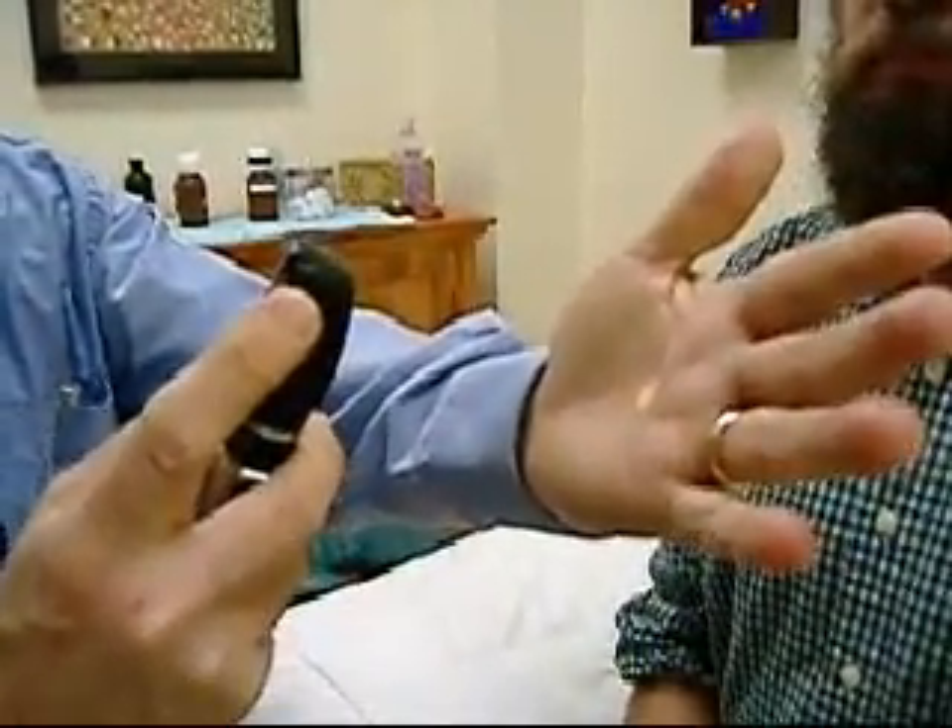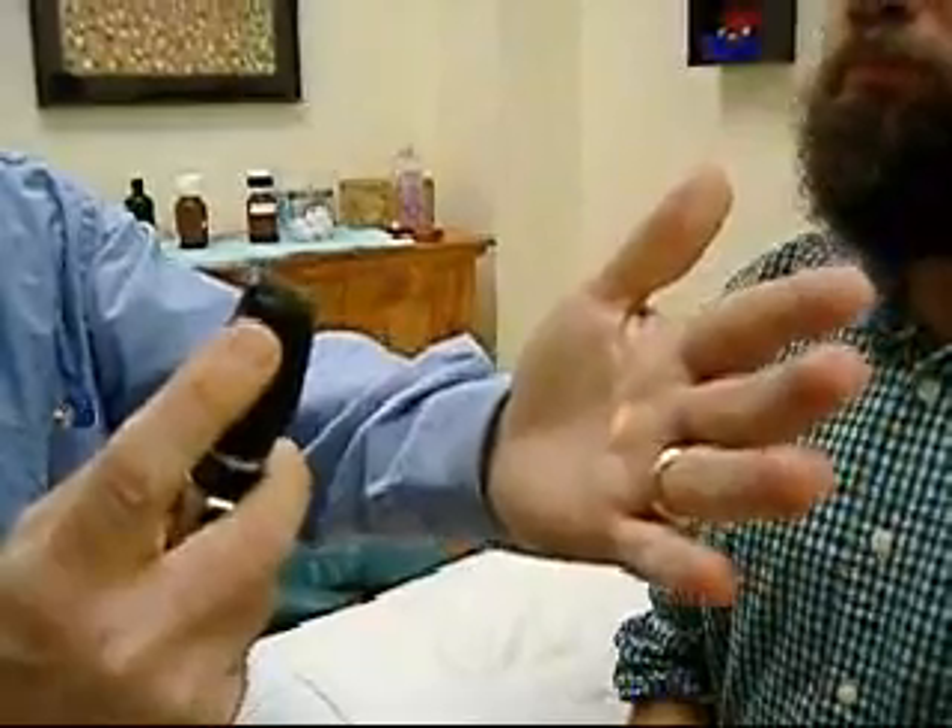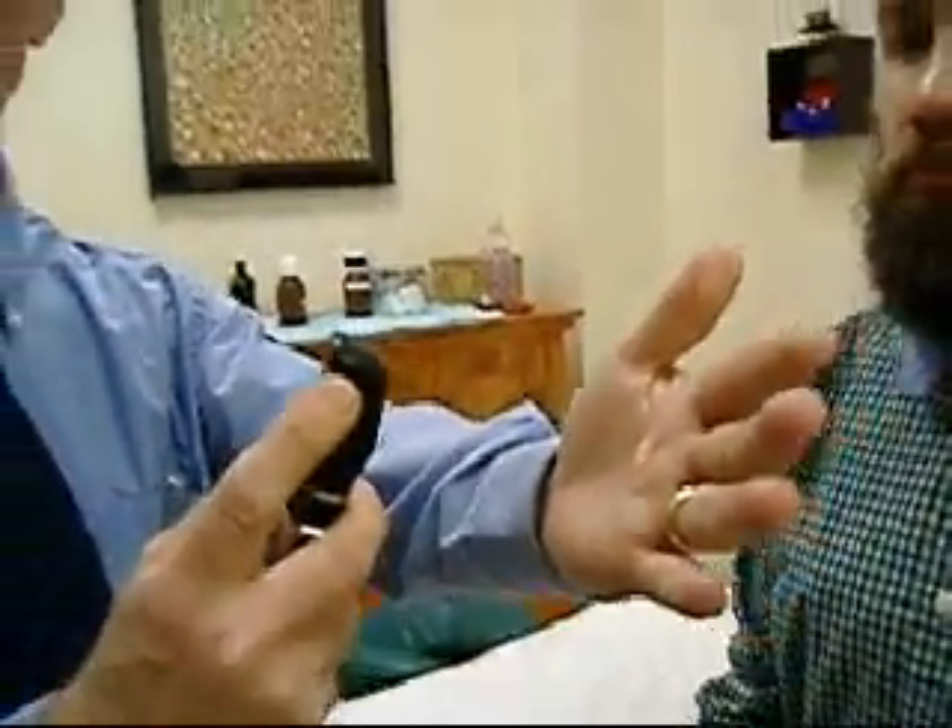There are various settings. You want to use the one that will give you the minimum stimulus, because that will leave the pupil open longer.